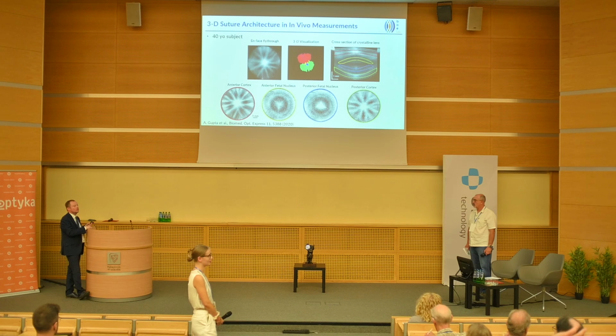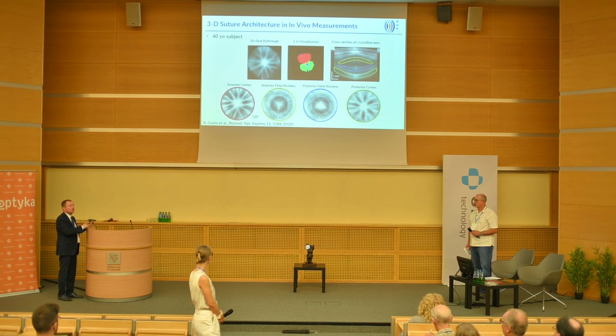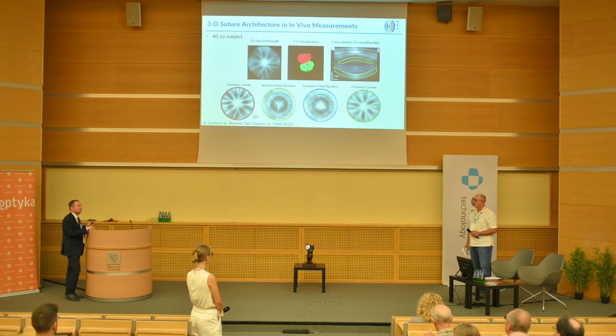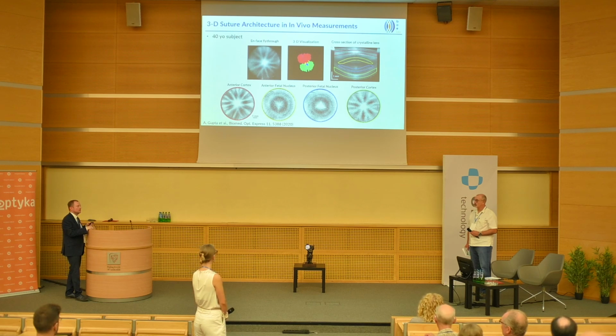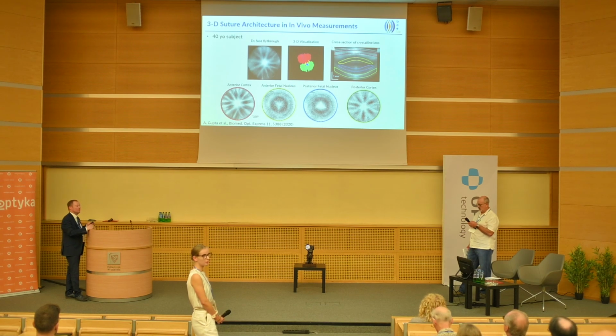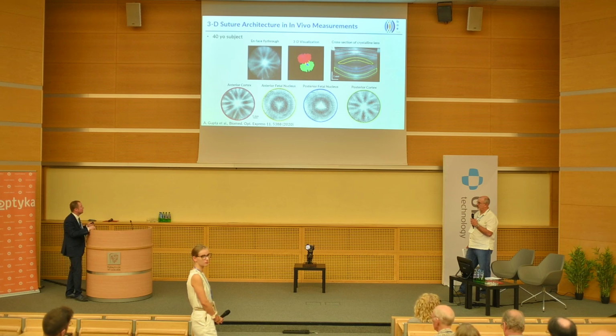Three-dimensional data. Okay. And remember that OCT data usually are shown in the logarithmic scale. Because we have access to the raw data, we have to use the linear scale. Do you use raw data for that? Yes. Of course, this is related to the power that you have on the eye, so from system to system it may change. But the commercial system will not provide you access to raw data. Simply speaking, you have just images, JPEGs.